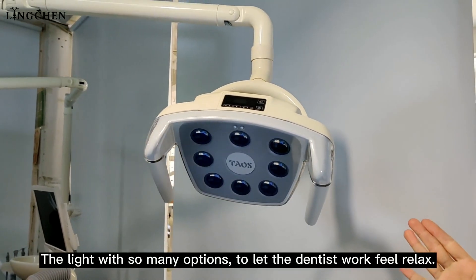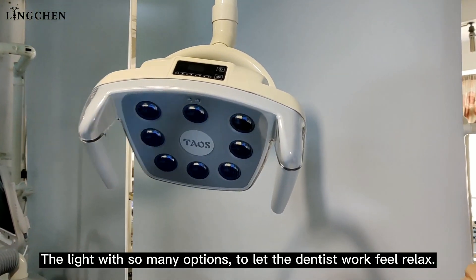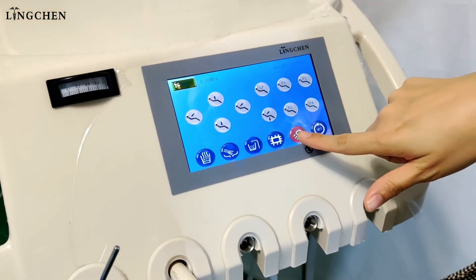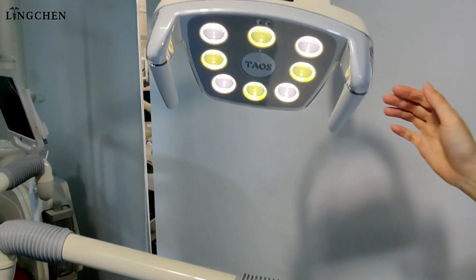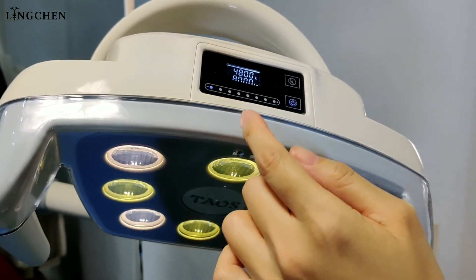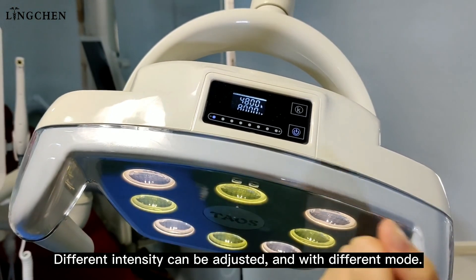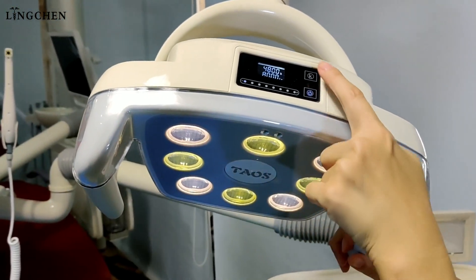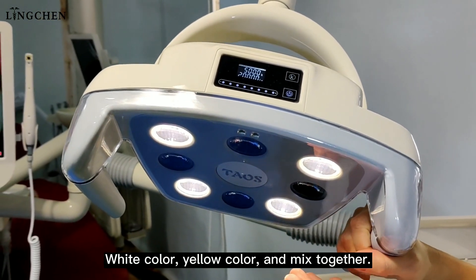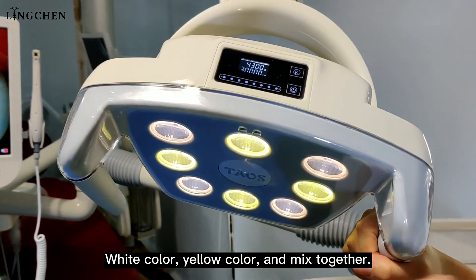The light comes with many options to let the dentist work feel relaxed. Different intensity can be adjusted, and there are different modes — white color, yellow color, or a mix of both together.